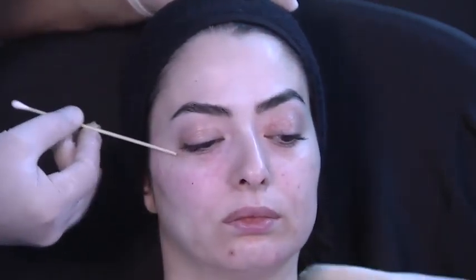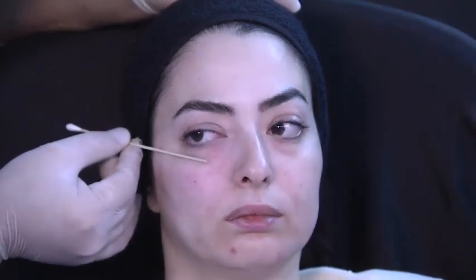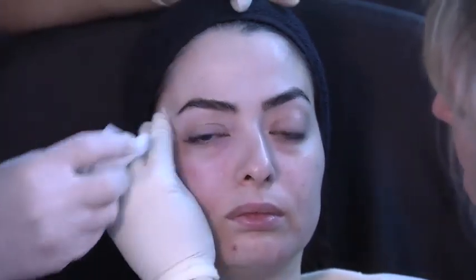Even though we inject deep, part of the product can go through the muscle and you can have a Tyndall effect or a retention of water. So when they have eye bags, I always maintain that little tear trough. I just wanted to show you also that there is a possibility when you have a lot of palpebromalar groove, you can also do this lateral approach for this area, okay, which is what I want to show you to finish with this patient.